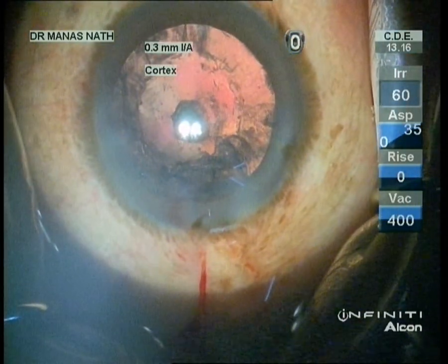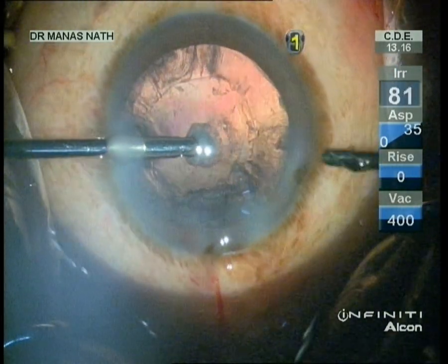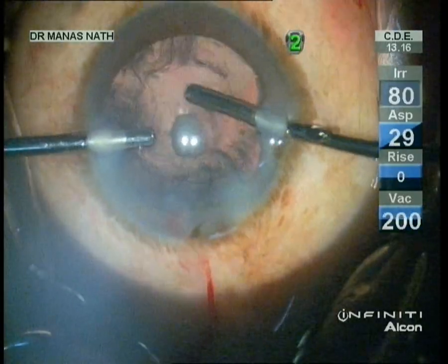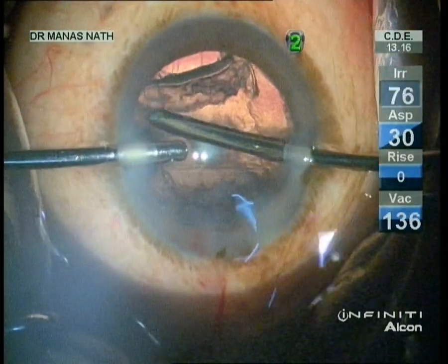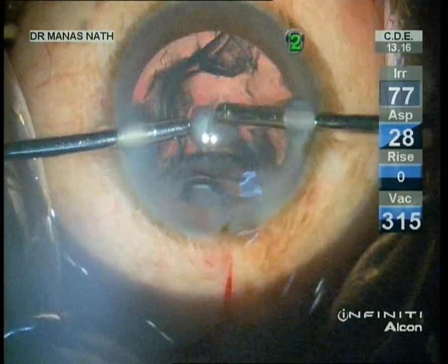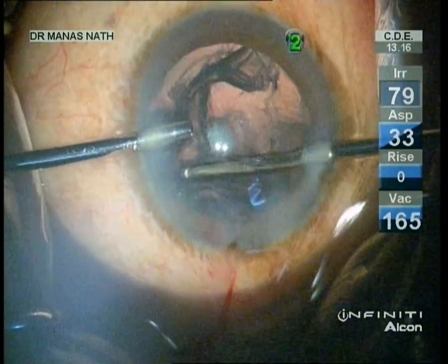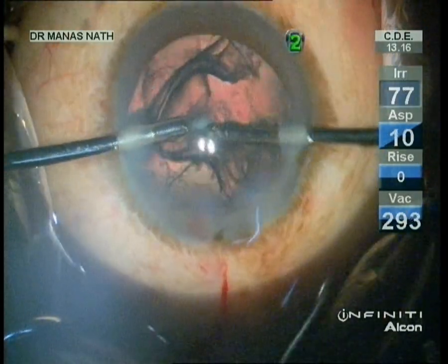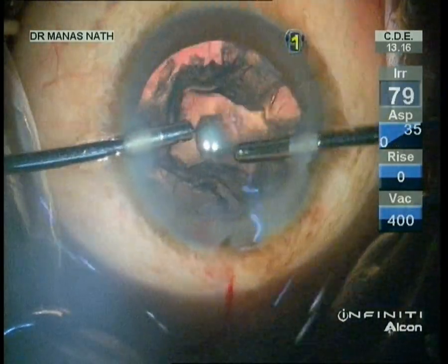I'm now inspecting the posterior capsule — it looks a little bit intact. I'm initiating bimanual irrigation-aspiration. My plan is not to peel the central part first; I will do it at the end. So I'm bringing the epinucleus sheet along with the cortex from the periphery towards the center. You can see that the central part is still attached.